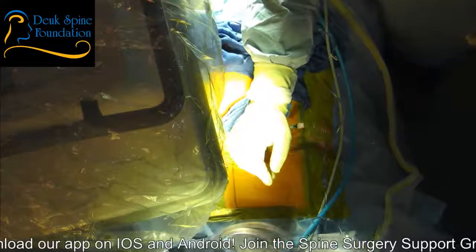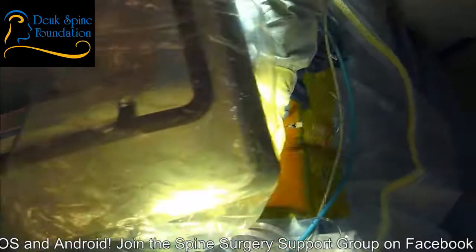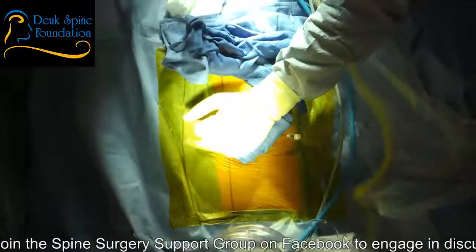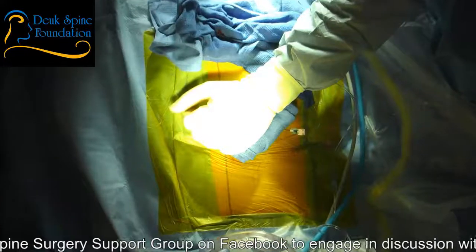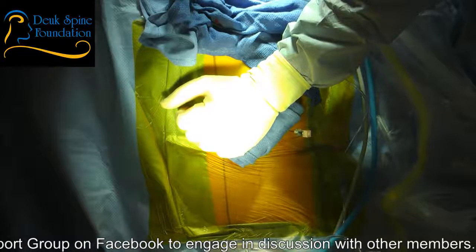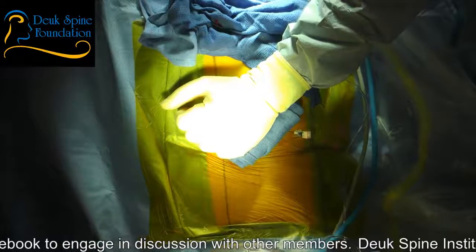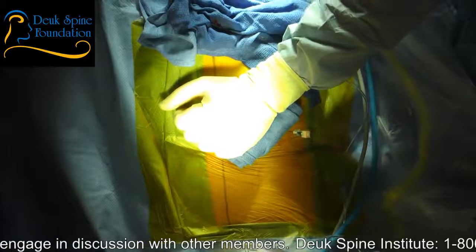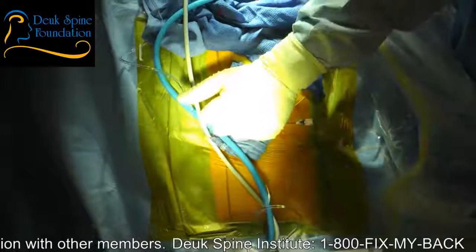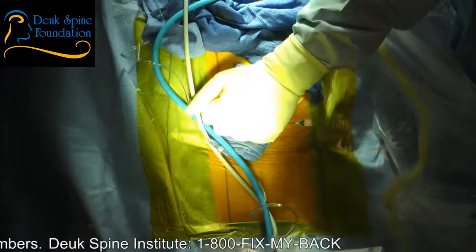Let's go lateral, please. All right, so we finished the L4-5 disc, and now we're going to go to the L3-4. Remember, the L3-4 was the one that's causing her back pain, and the L4-5 was causing the leg pain. I think L3-4 will also be contributing to the leg symptoms as well. So when people send me their MRIs to review, I'm looking for the cause of their symptoms. What's causing their back pain? What's causing their leg symptoms? Is it the same thing or is it different? And sometimes one disc will be causing the back pain and the other disc will be causing the leg pain, or neck pain and arm pain.